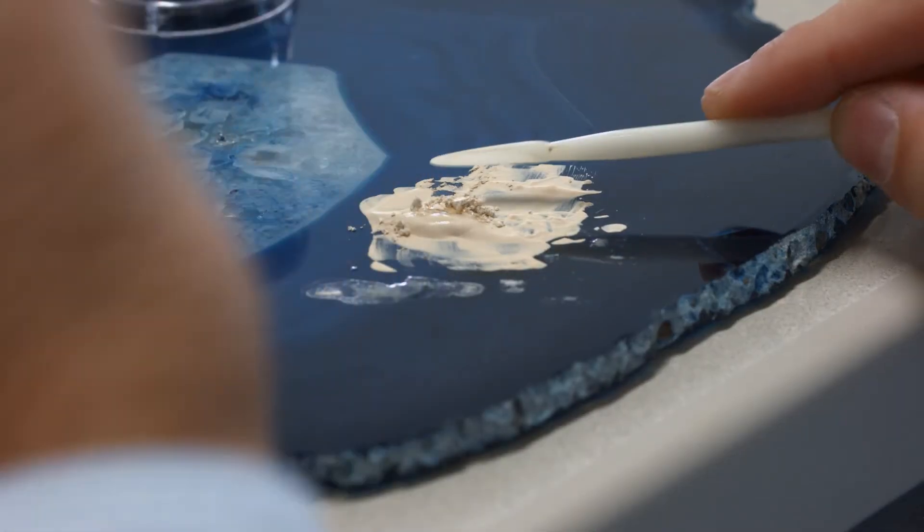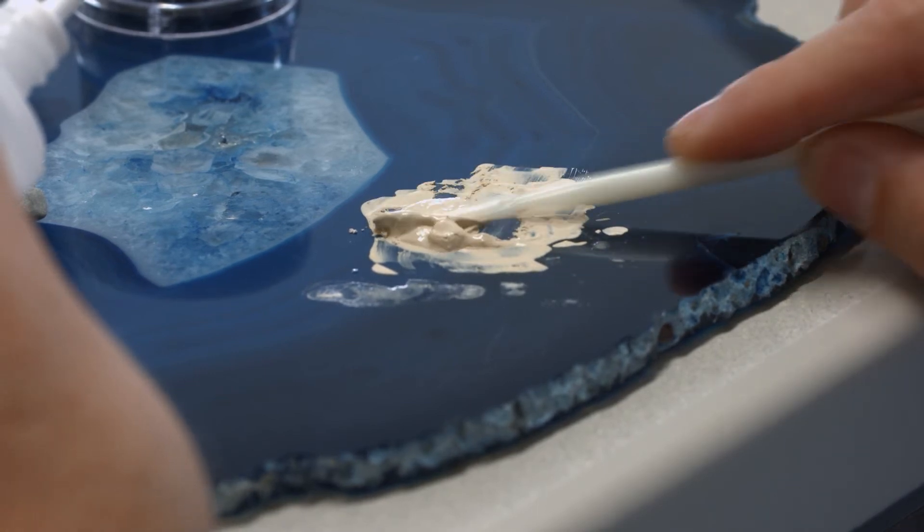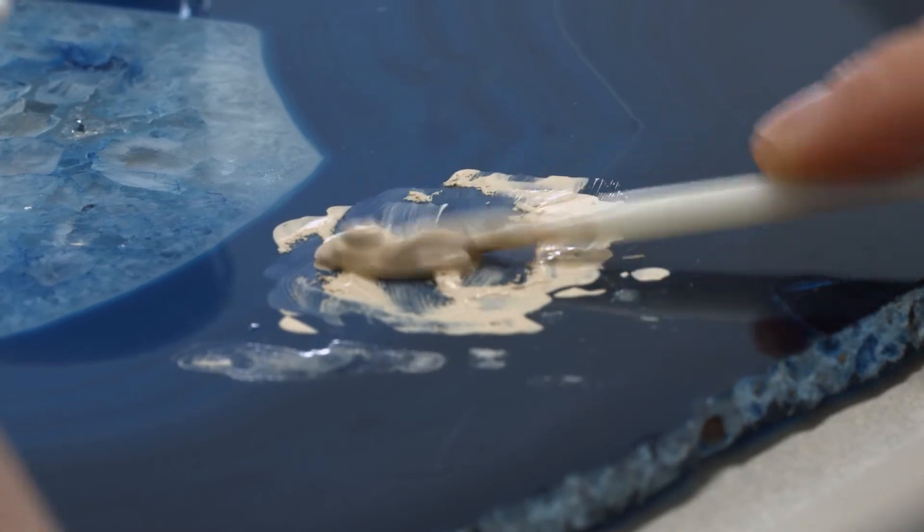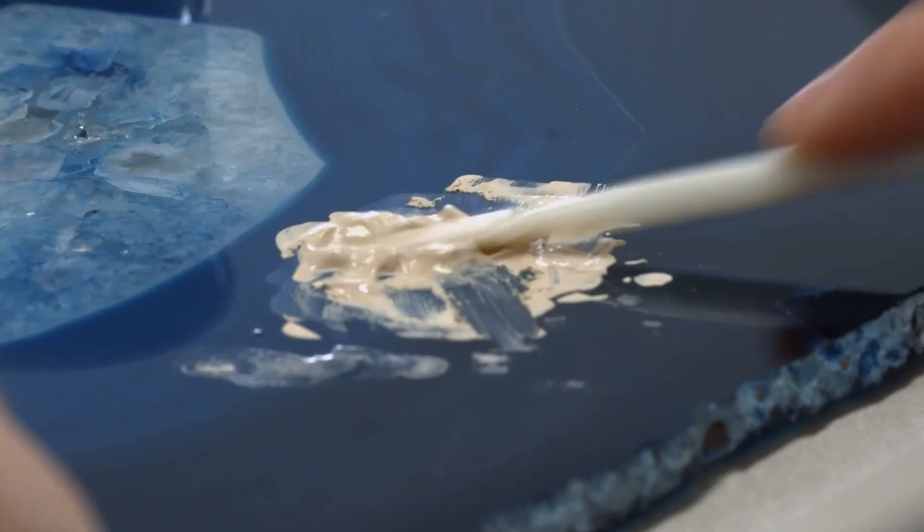Remove the amount of opaquer powder required for the covering layer from the jar and add it to the dried wash opaquer residue on the mixing pad. Mix everything to the desired consistency with some IPS powder opaquer liquid.